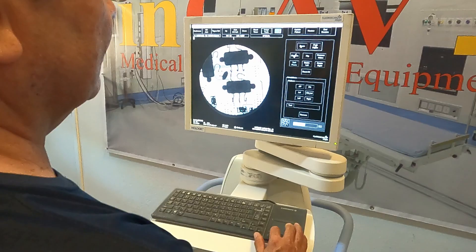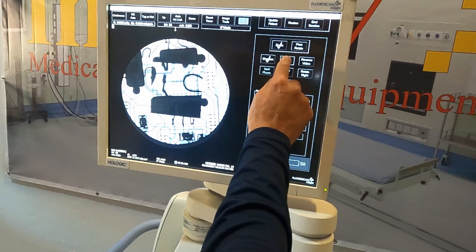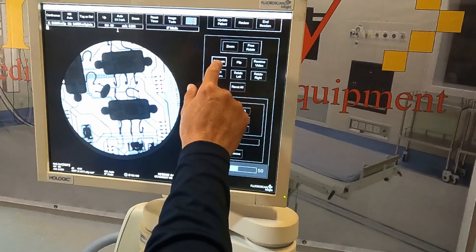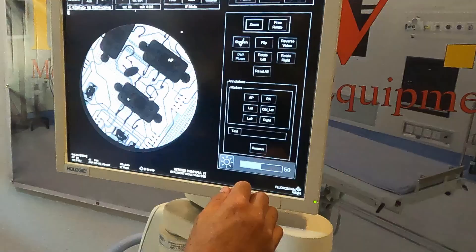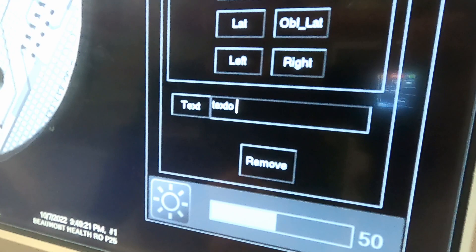In editing mode, we can zoom by clicking on the image and scrolling over. We can also do rotation, reverse, or even flip the image all the way. There are many ways to edit. We can also add some marks or even text to the image, and as well we can adjust brightness and contrast.